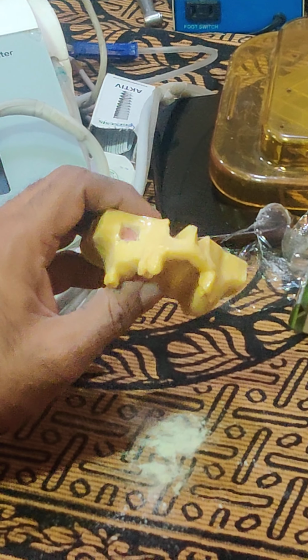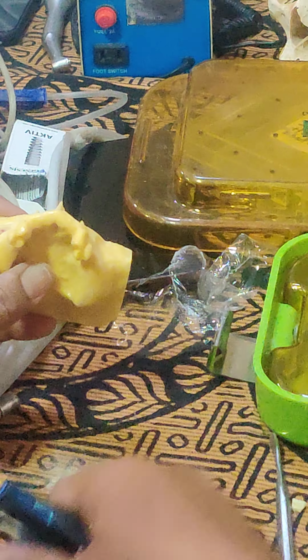Membrane will be tightly adhering to the bone. Okay, we are supposed to separate the membrane and then lift the floor. Lift the floor and place the graft. So that is what we are going to do in sinus lift. So for lifting and separating, we have a separate set of instruments called direct sinus lift instruments. Indirect sinus lift instruments, but again very cheap, 85,000 rupees only.